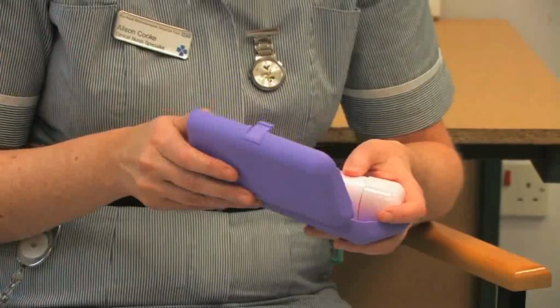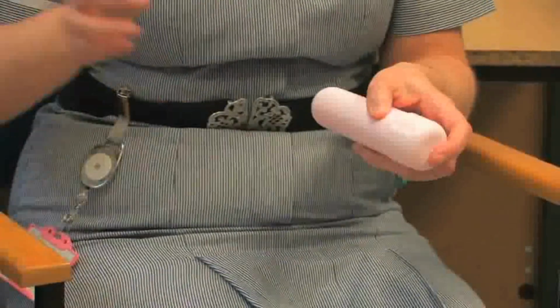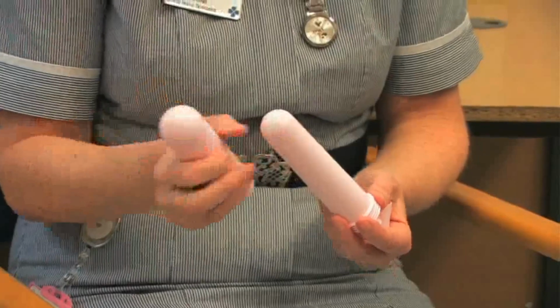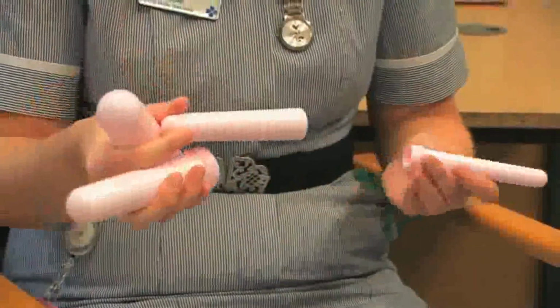This is the Femax set of dilators, which comes in this discreet case that looks a bit like a spectacle case. Inside are the set of dilators. When you get the dilators out, you will actually see the largest one first, which sometimes can alarm ladies. There are 4 dilators in the set, and they fit inside each other a bit like Russian dolls.